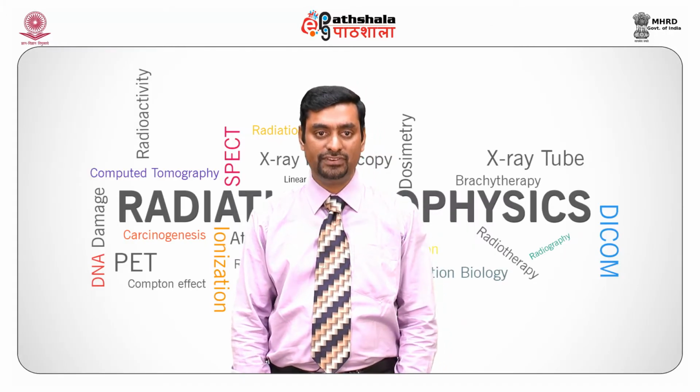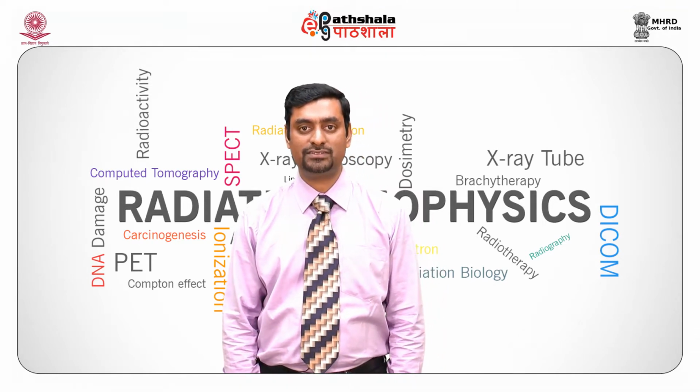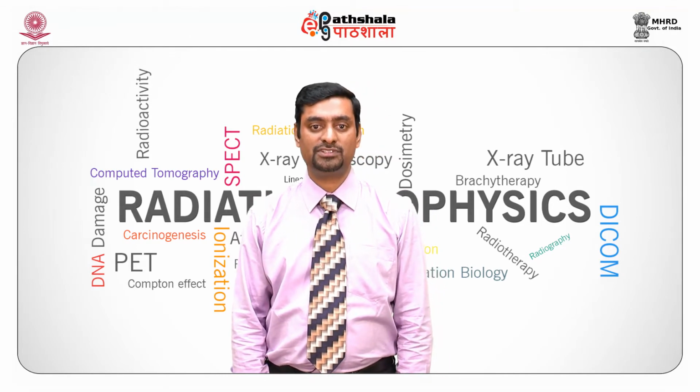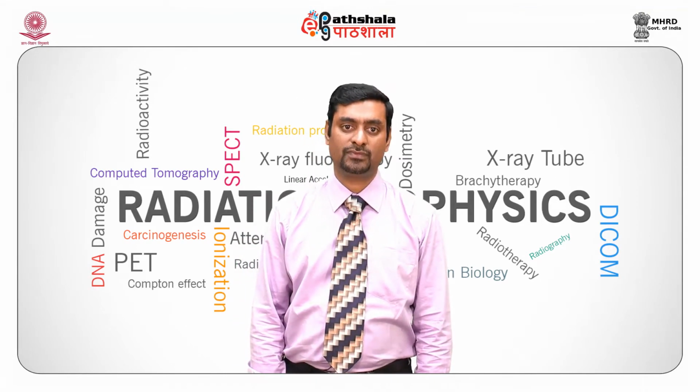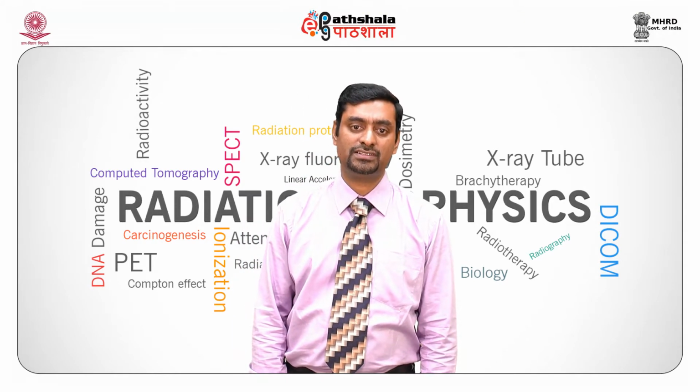After that, we have the filters. The work of the filter is to reduce the low energy X-rays that can be absorbed by the patient tissue without being transmitted to the detectors. Aluminum or copper is commonly used as an added filtration material.